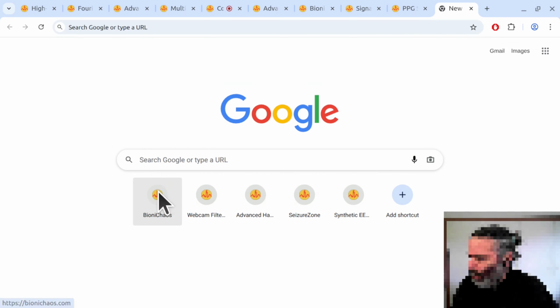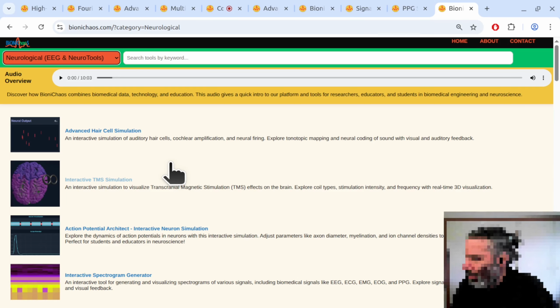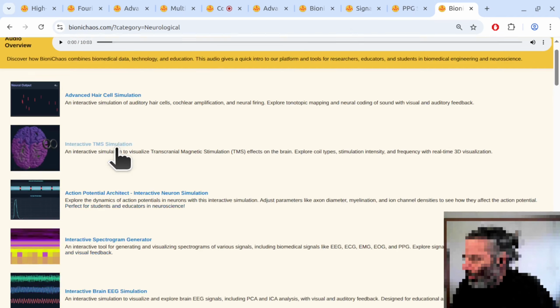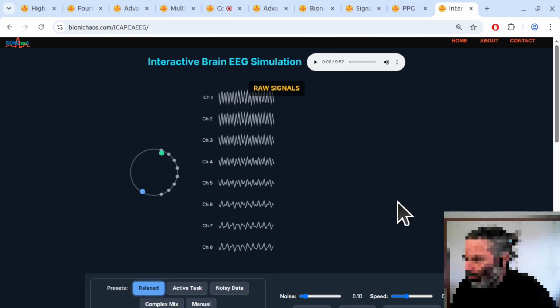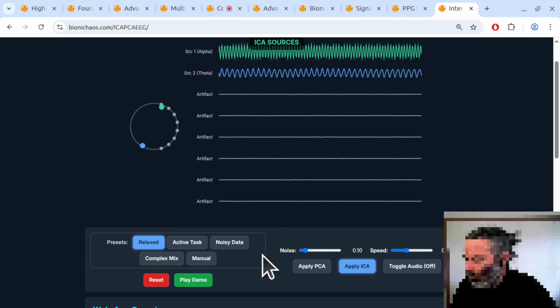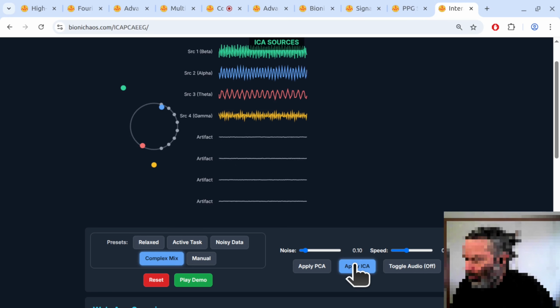ICA algorithms like Infomax or FastICA are designed to mathematically separate out different independent signal sources mixed together in the EEG recording. They're great at finding those unique brain signals, which often have shapes that aren't simple bell curves, what we call non-Gaussian. And they can pull out spiky artifacts like noise from an fMRI machine if you're doing simultaneous recording. Okay, so that cleans things up. What else is in the toolbox?